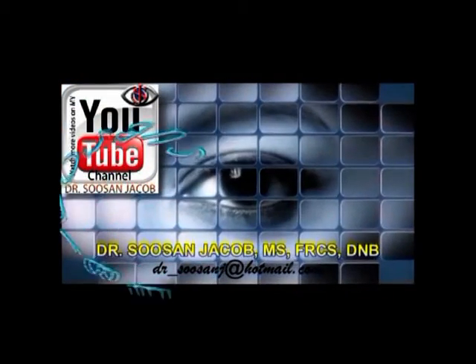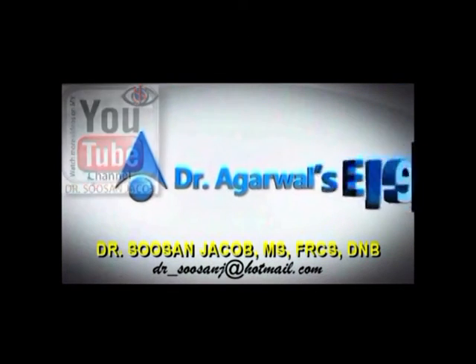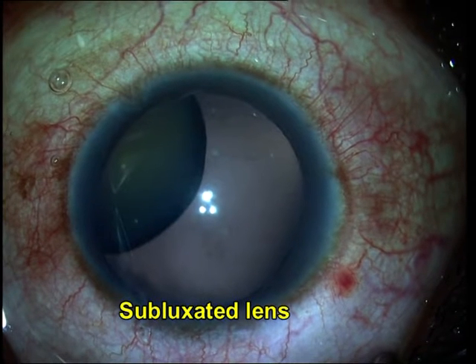Hi everyone, I am Susan Jacob and in this video I am going to show you a case of a subluxated lens in a young boy which left his pupillary zone largely aphakic, and he needed an aphakic correction for improving his visual acuity.